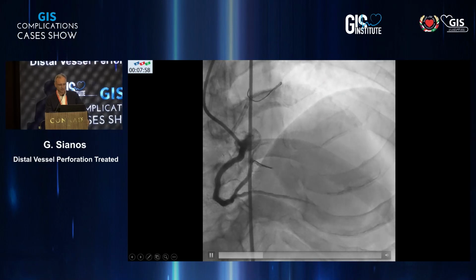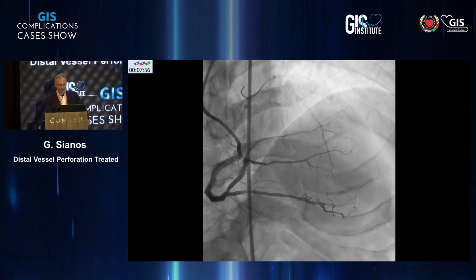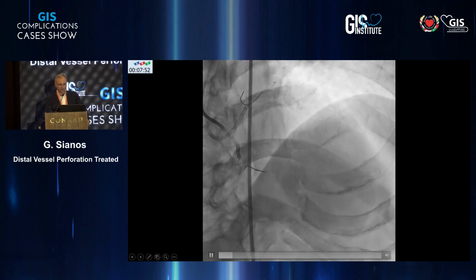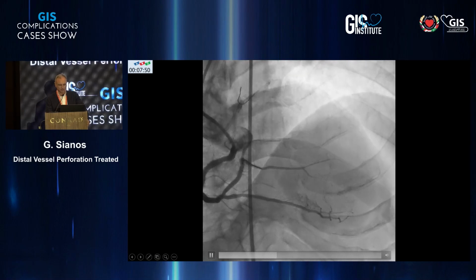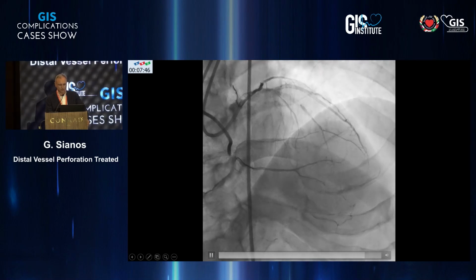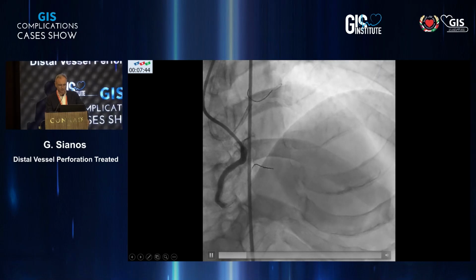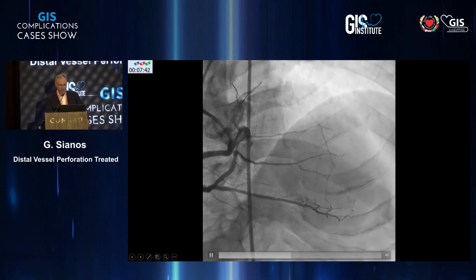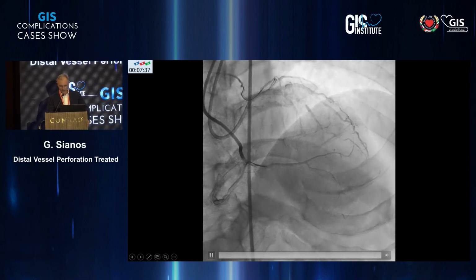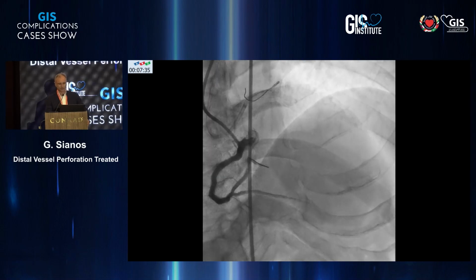The distal LAD was not really a very impressive vessel. What I would like to bring to your attention is that the collateral circulation consists of these two, or one septal in my view. This vessel here, the second one, should be an epicardial collateral, and there is an epicardial end-to-end collateral from the distal LAD to the distal PDA.